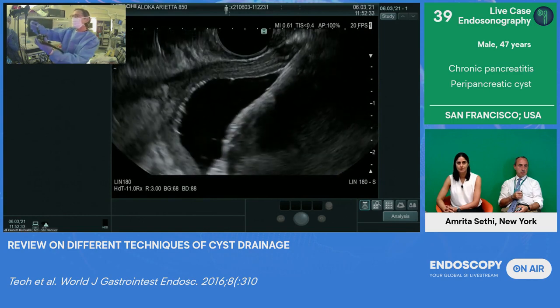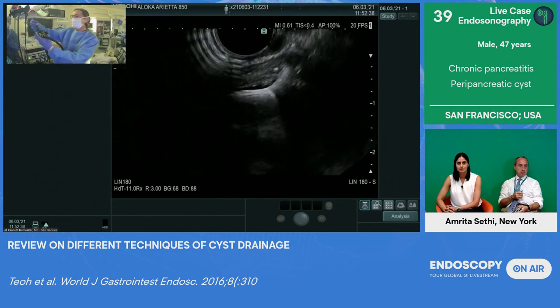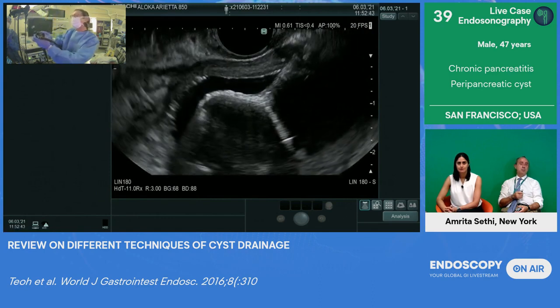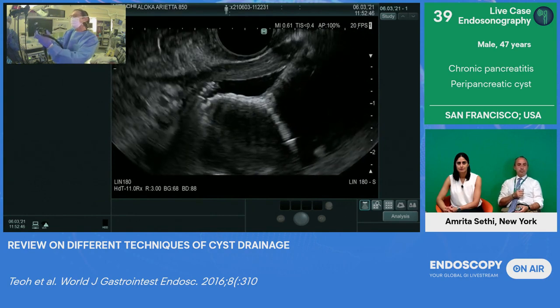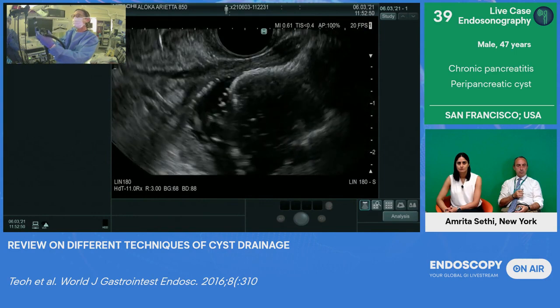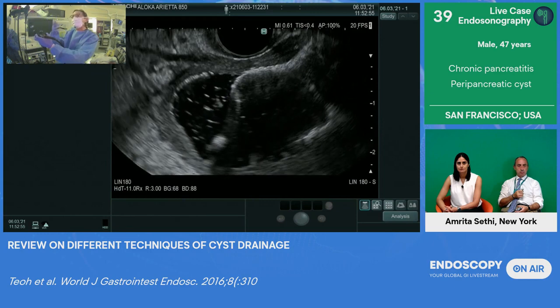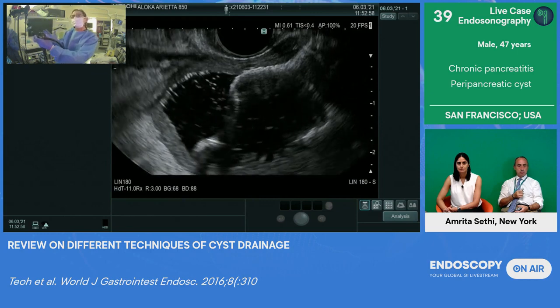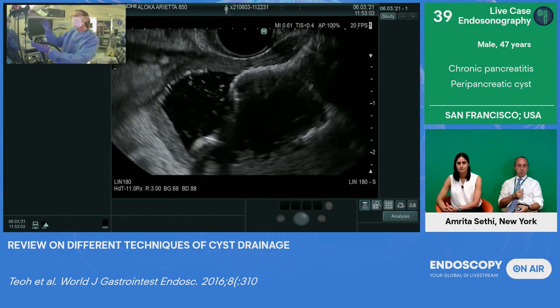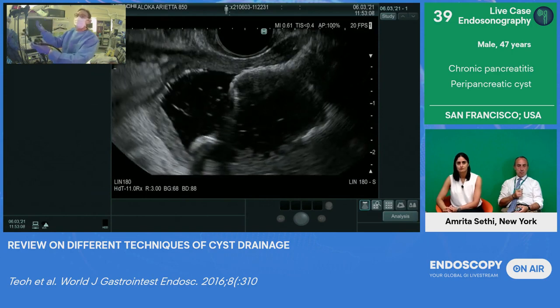Slowly, pushing the catheter forward a little. Coming now, right? There it is. Now it's fully deployed. It's a nice big disc, right? Now you want to snug this up against the wall of the cyst like this, like that. So I won't deny this is a relatively big LAMS for the size of the cyst. But as I said, I want to get excellent drainage afterwards. It's really about the risk of the LAMS getting occluded with some debris and necrosis or even food afterwards.